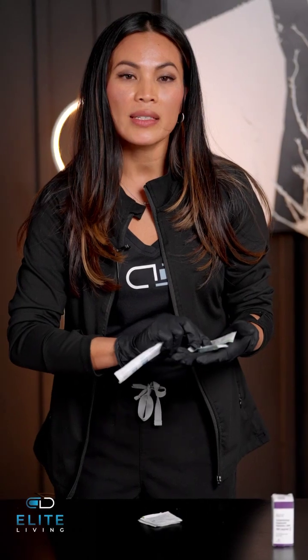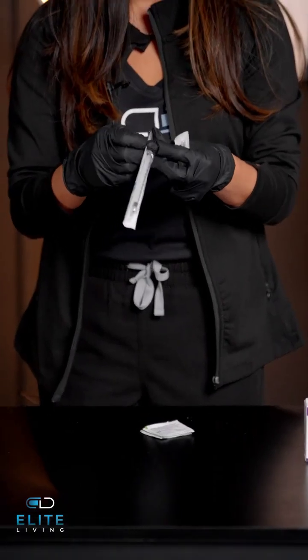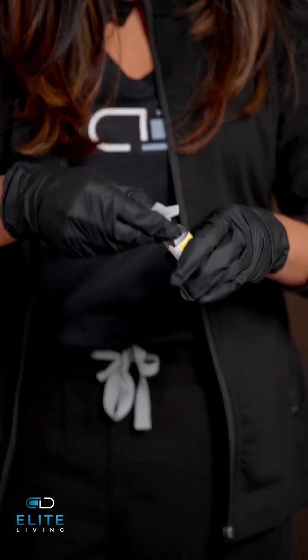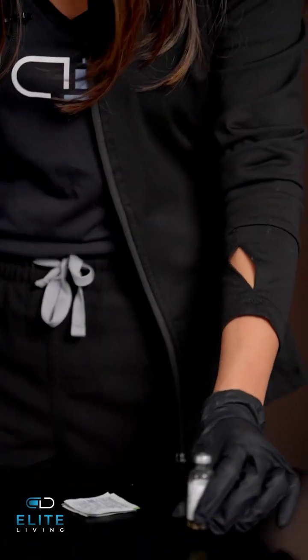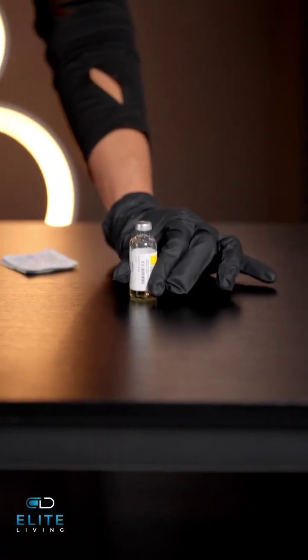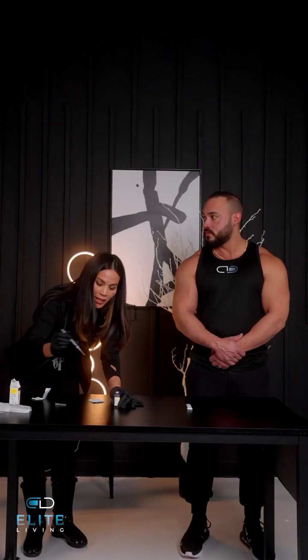Just remember that the smaller number represents the bigger gauge. I'm going to go ahead and take out the syringe. I'm going to be administering half a cc from this vial. Go ahead and always clean the top of your vials before you draw out the medication. I like to hold the vial in place just for steadiness.